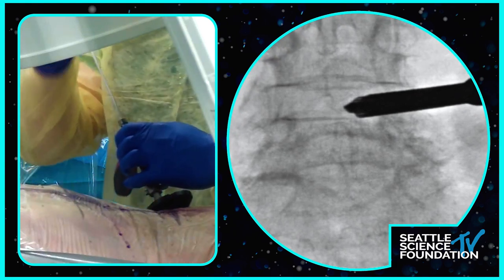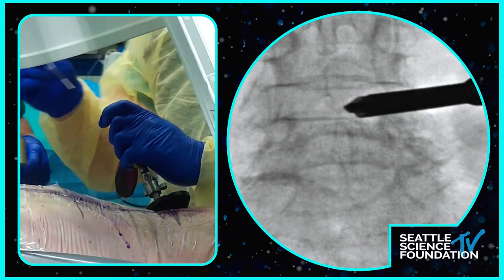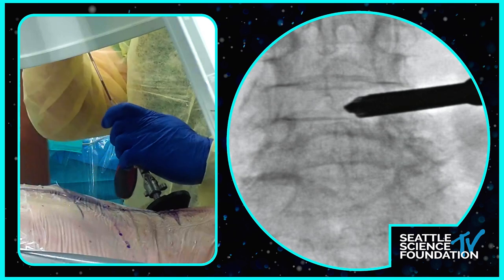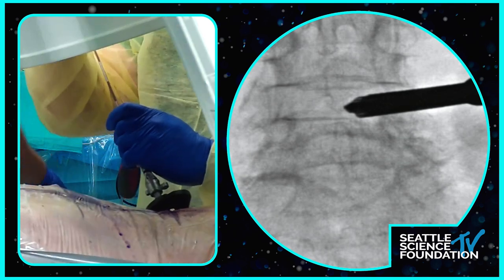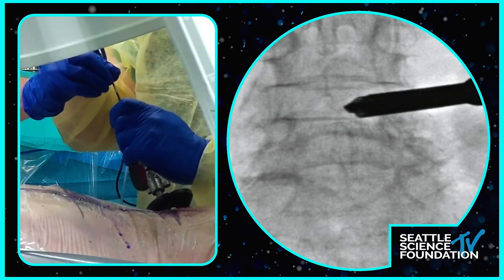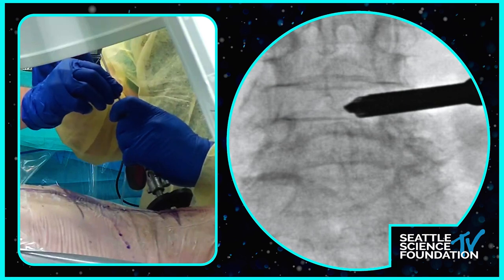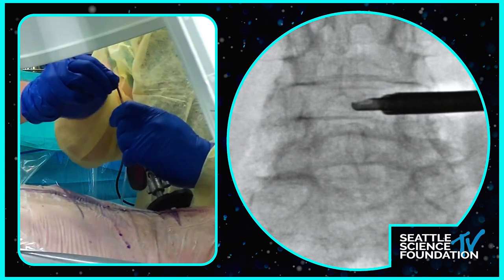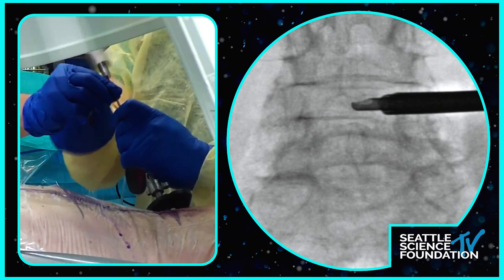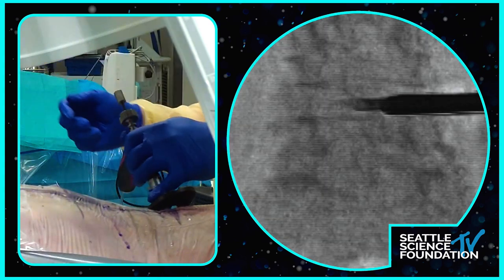So now that the implant's in, tell us, right now the bone graft is going in. You have the expandable mesh cage already in place, right? And now you're inserting the allograft, which leads to expansion of this cage. Can we get a lateral to see how this expands? Picture there. Ray, you want to get a lateral to see the bag expanding? One more picture there. Let's go lateral.